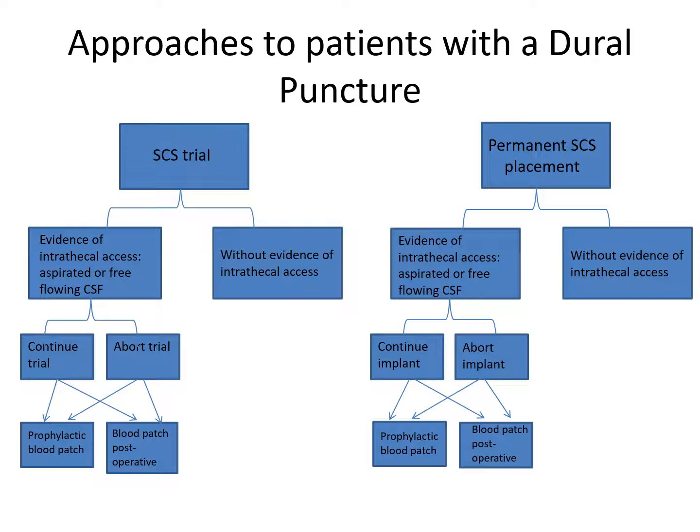There may also be an undiscovered dural puncture at the time of spinal cord stimulator placement. This can occur if the bevel punctures the dura but no CSF is visualized, or during forceful guide wire or lead insertion. If this occurs and is discovered in the postoperative evaluations, the patient can be managed with conservative treatment or an epidural blood patch can be performed at that time.